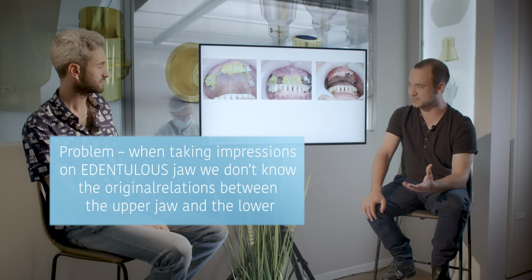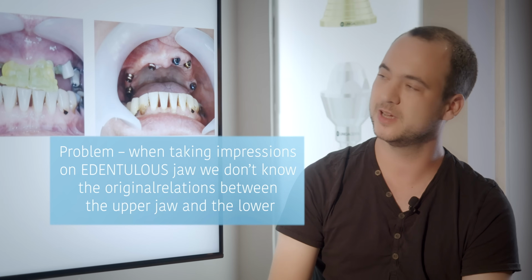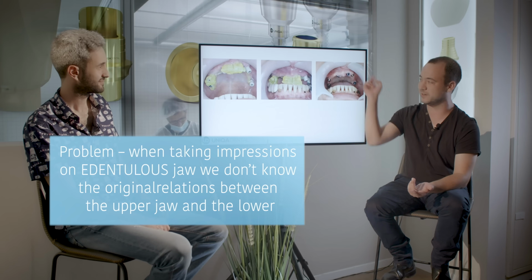When you're taking impressions on a complete edentulous jaw, you have a problem because you don't know the relations between the impressions. You can take impressions very good on the upper jaw with different types of scan abutments, everything you want. But then you don't have any relations with the lower teeth. So how do you make a bridge with proper relations?